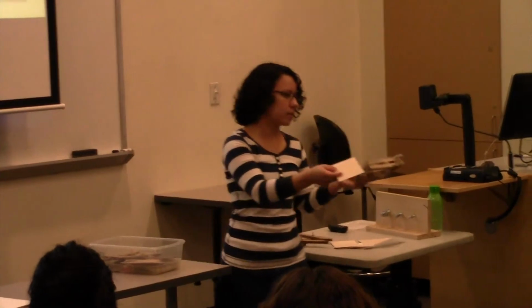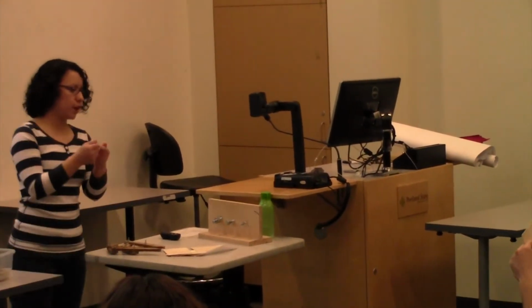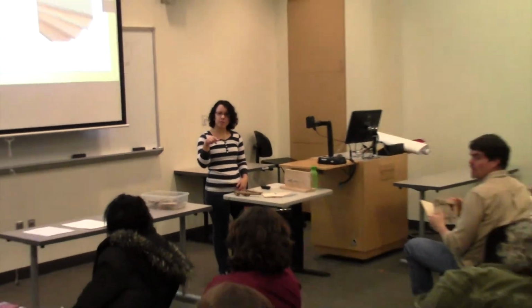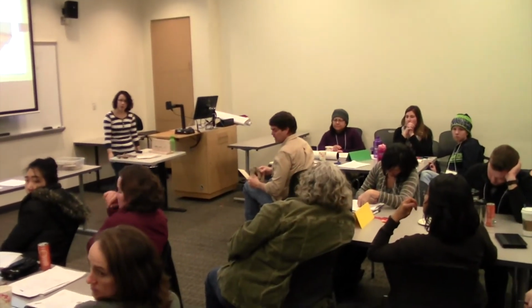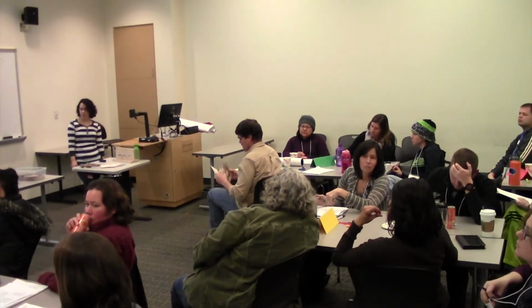And I can pass this around if you guys want to take a look. Just how strong it got for just cross-graining them and gluing them together. It gets really strong really fast. Are balsa wood sheets like that very expensive? Tamara, you know how much this is? It's not terribly expensive, and if people are interested in doing balsa wood, we can look at doing a bulk order.